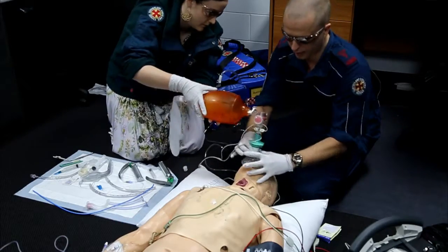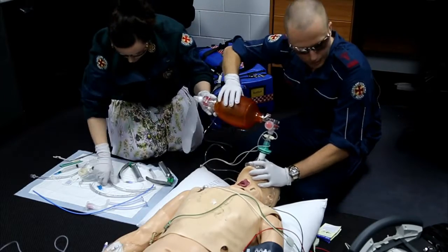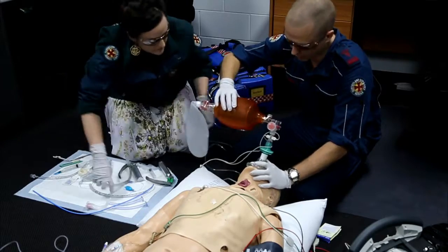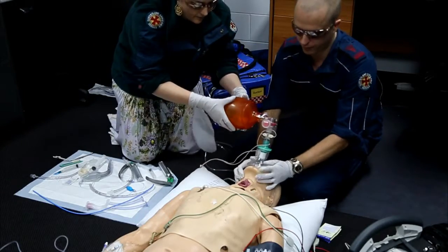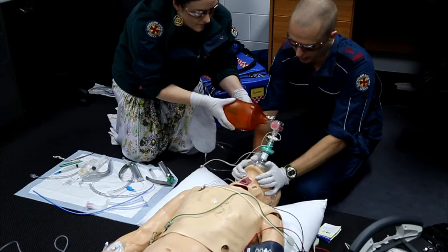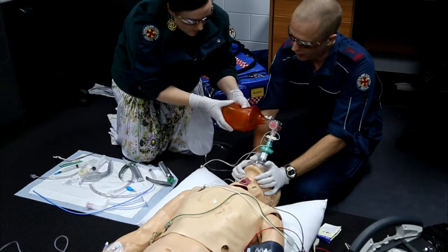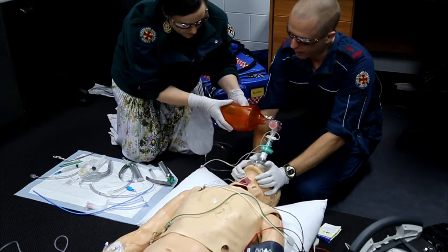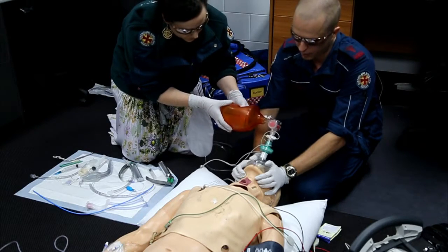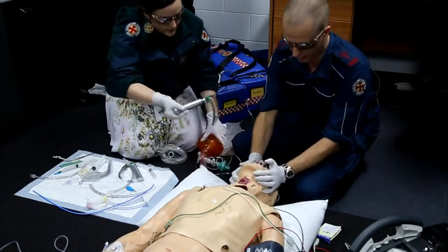Okay, I'll try one person. Yeah, I can feel air leaking, so I'm going to go to two person. Okay. So that's working. So we'll say for the point of the exercise we do that for another 30 seconds and return him to his pre-induction state and make another attempt. Okay, to intubate. Alright, so let's pull that off.